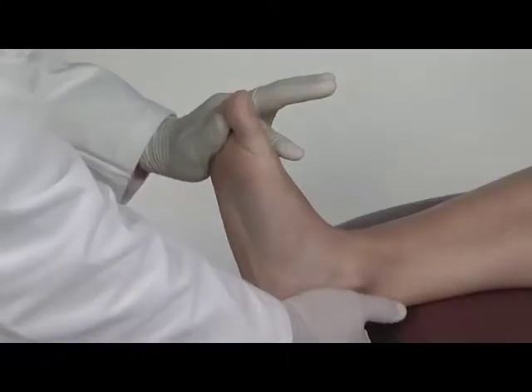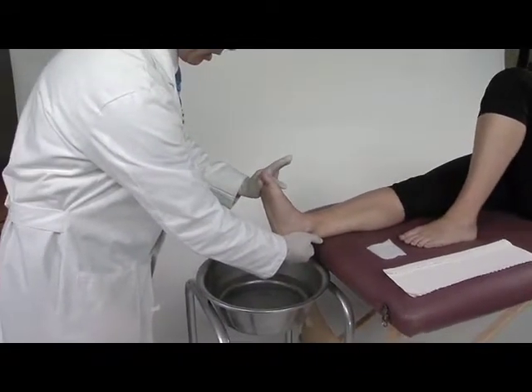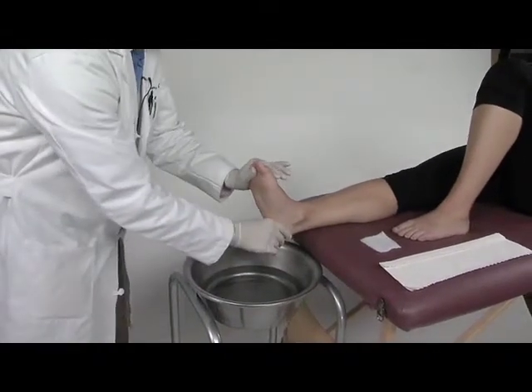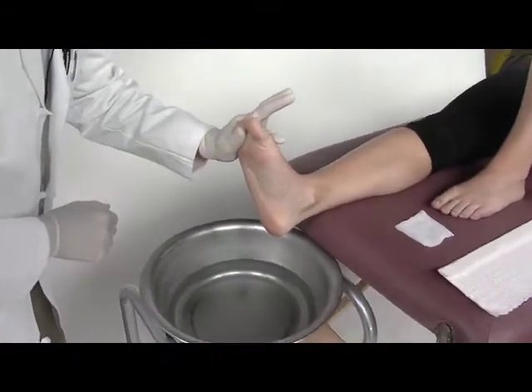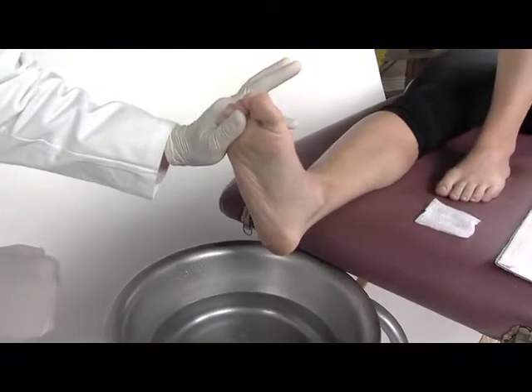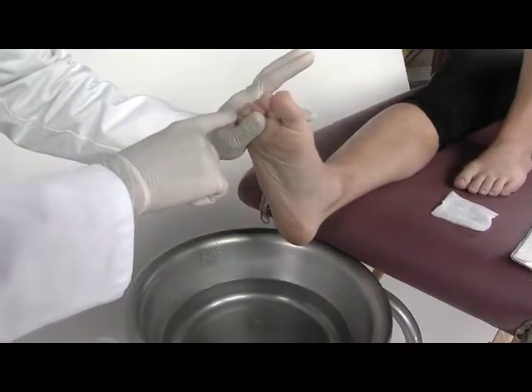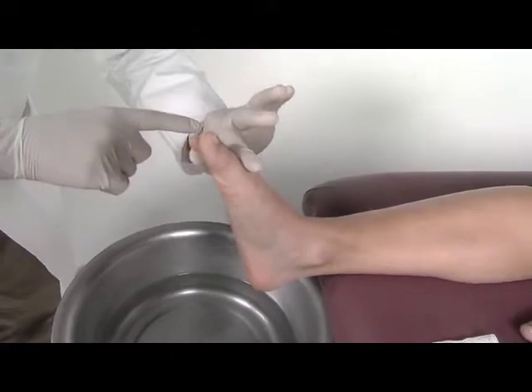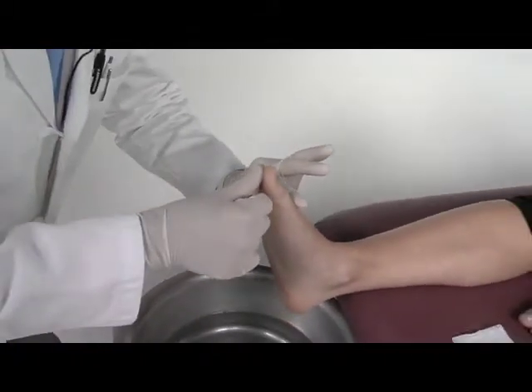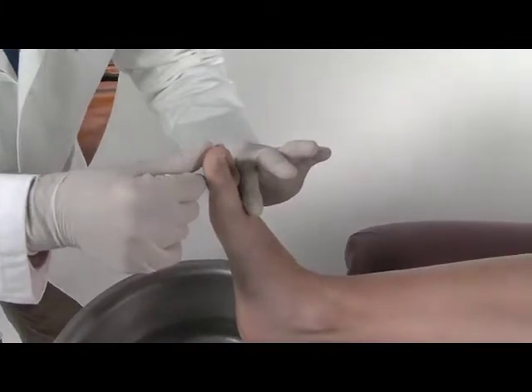Lisa here is in the supine position, and the position that I'm going to hold her foot is right like this. A couple of the landmarks I'm looking for are straight toes all the way across — not dorsiflexed, not plantar flexed — and I want the toes to simulate as if she was standing on the ground and putting weight on her foot.